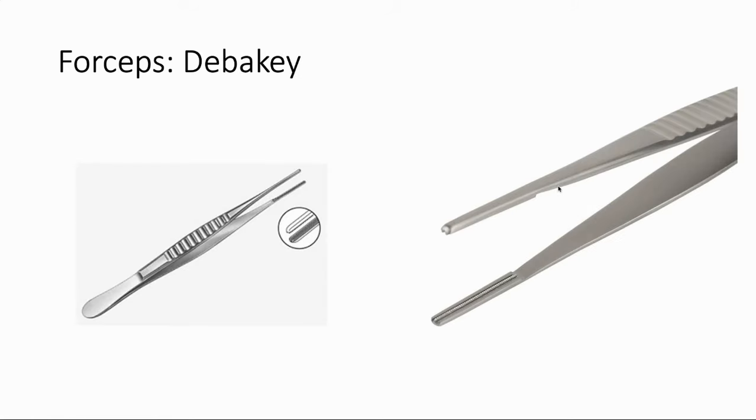For contrast, we have the DeBakey forceps. As you can see, it does not have the big tooth on the end the way the Adson's does, so it's more of a blunt forcep. You do not want to use this on the skin. We use this a lot in the abdomen to manipulate bowel, blood vessels, or things like that. The big thing to remember is don't grab the skin with this.